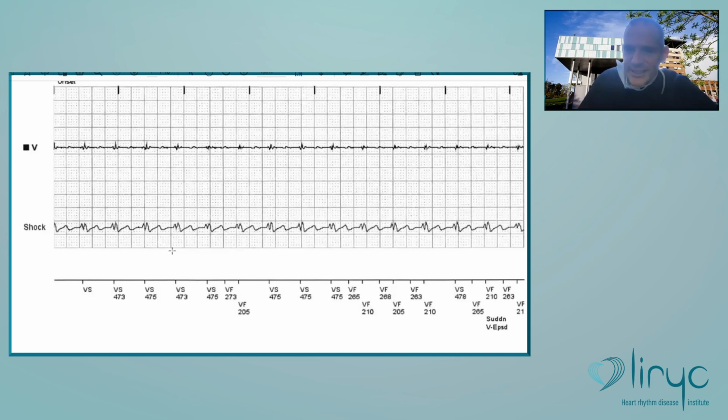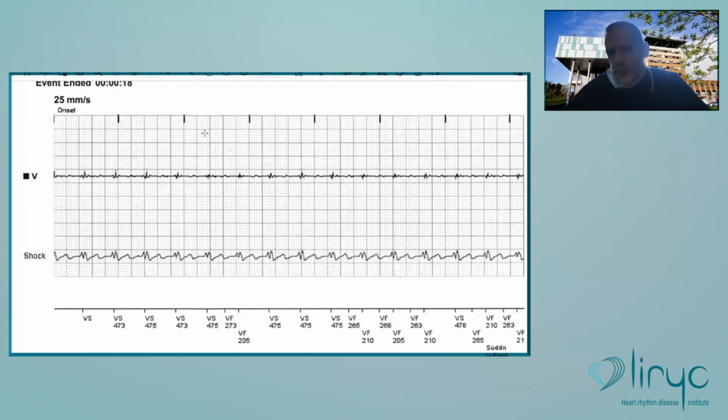Okay, for R-wave double counting, most of the time in the old textbooks, it was Biotronik also, because the post-sensing blanking was the shortest of all. It was 80 milliseconds in Biotronik, so you increase considerably the risk of R-wave double counting. Since it has been modified in the new platforms, now it's 110 milliseconds. The amount of double counting of the R-wave has also considerably decreased in the new Biotronik devices. Okay, any question?